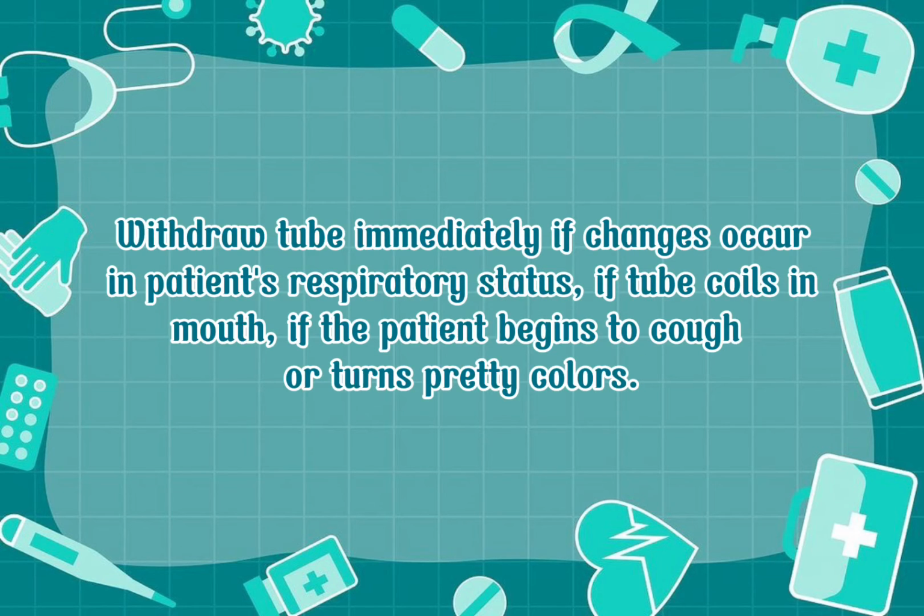Withdraw the tube immediately if changes occur in the patient's respiratory status, if the tube coils in the mouth, if the patient begins to cough or turns pretty colors. Advance the tube until the mark is reached.